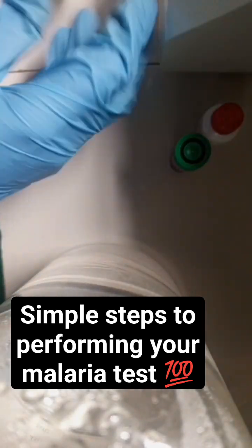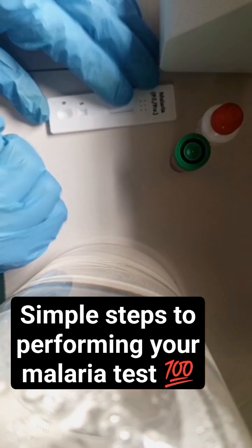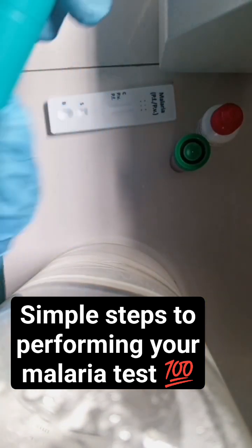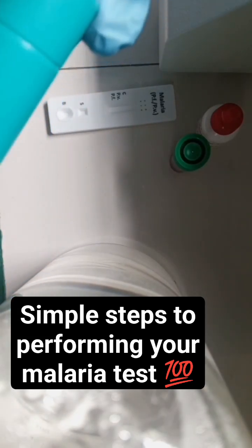Make sure you're on your gloves because you have to be careful. This is what I'll be using — ignore the calibration, you can use as little as 10 microliters to do this.